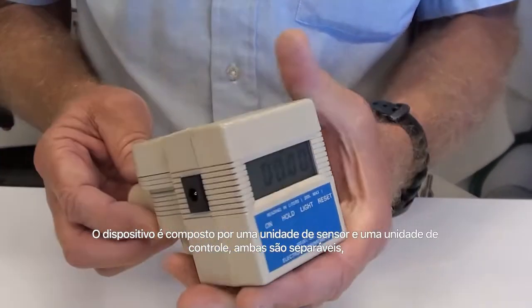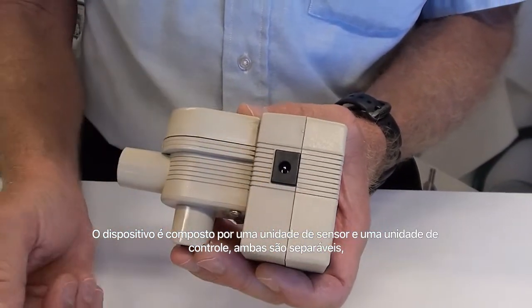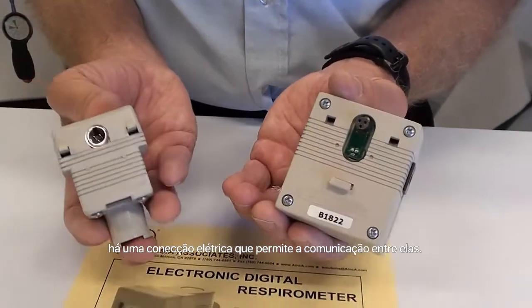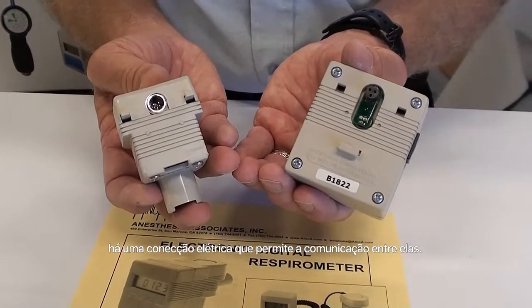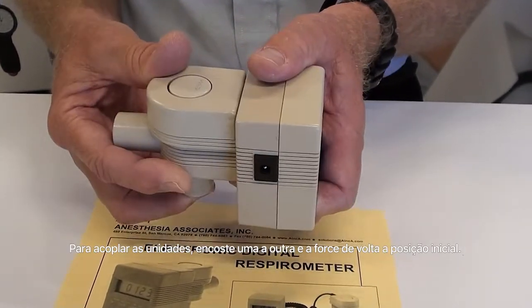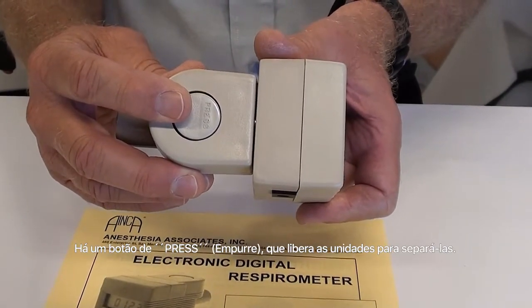The device itself consists of a sensor system and a control system. The two devices are separable, with an electrical connection that allows the two to communicate with each other. The two devices hinge onto each other and clip back into position, with a press button used to do the release.